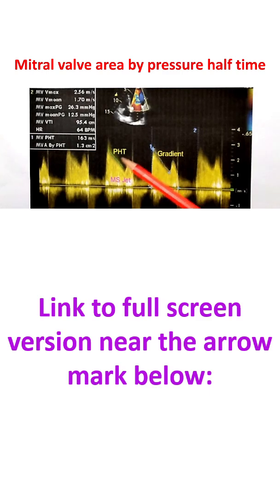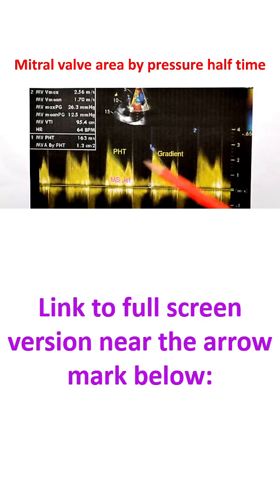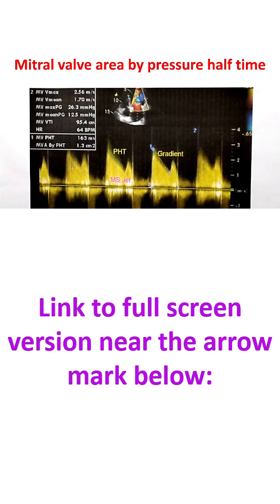Without mitral stenosis, the E and A waves will be independent waves with a nearly horizontal baseline in between. That is not seen in mitral stenosis because the stenosis creates a continuous gradient between the left atrium and left ventricle, which is what you are seeing here.